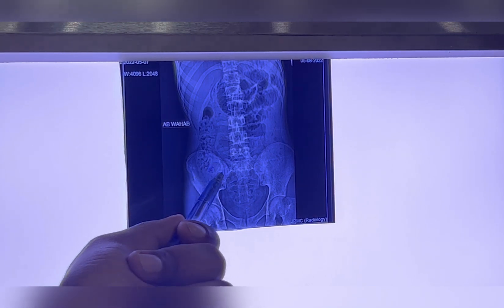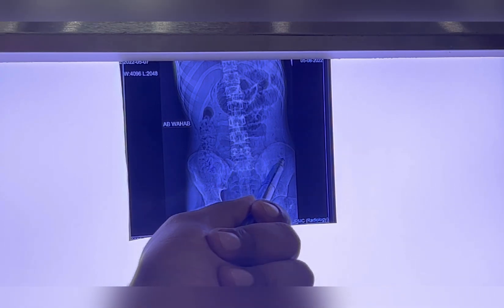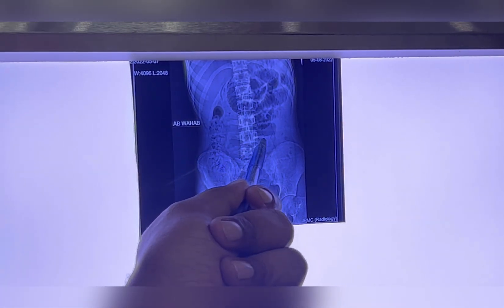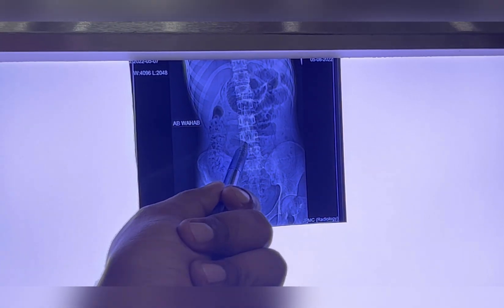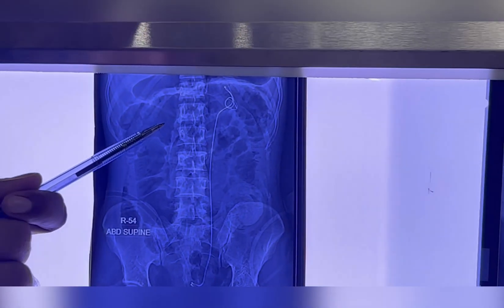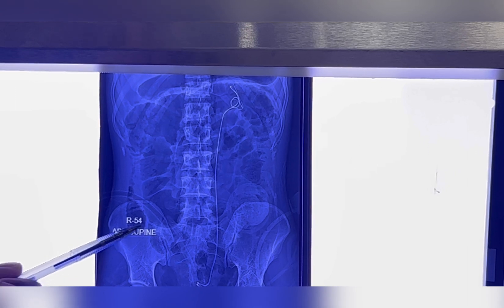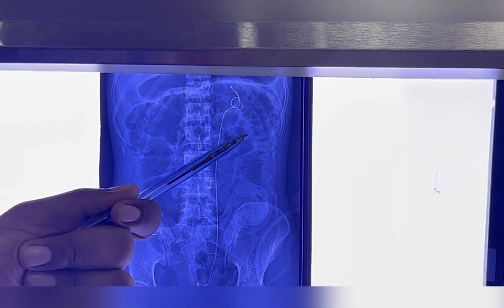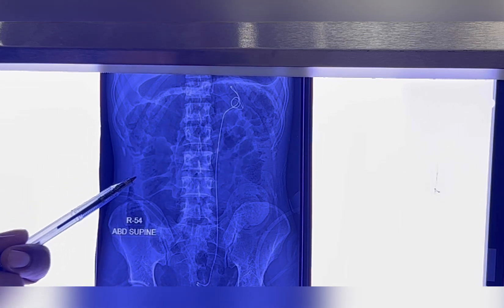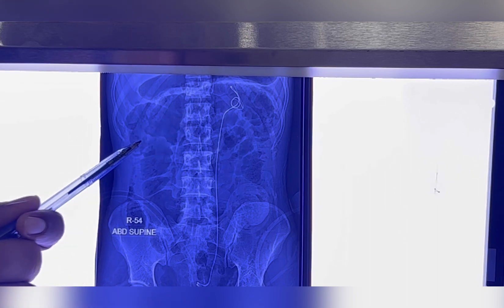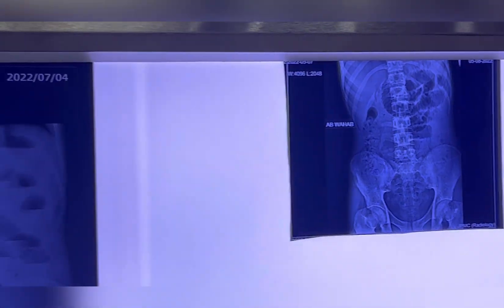For example, if gas is present in the cecum and multiple incomplete haustra are present in the gut — as shown in this other X-ray — you can clearly see air in the cecum, which means obstruction is distal to the cecum. These incomplete cuts in the gut are called haustra. If haustra are present, it is large bowel; if complete cuts (valvulae conniventes) are present, it is small bowel. If incomplete haustra are present, it is large bowel.